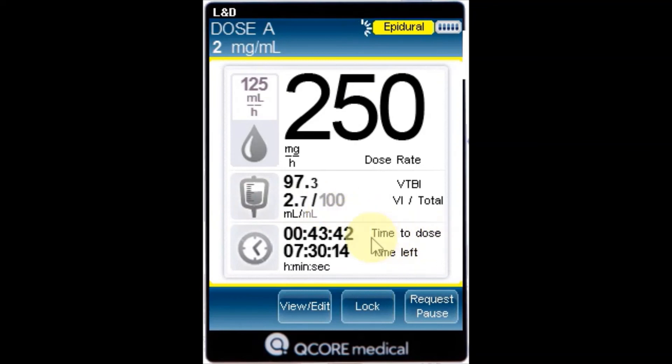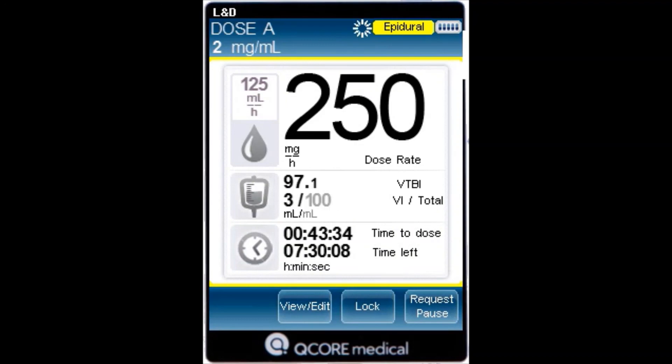Time to dose: time remaining before the next dose starts until the end of the current interval — dose time plus KVO time. Time left.